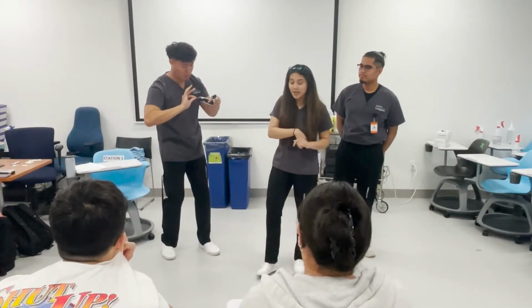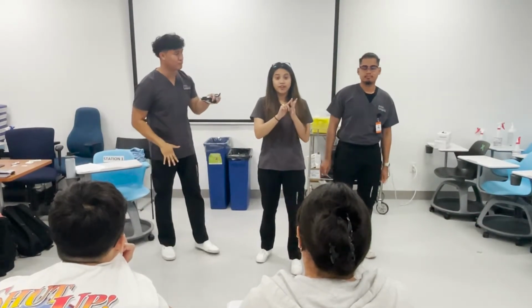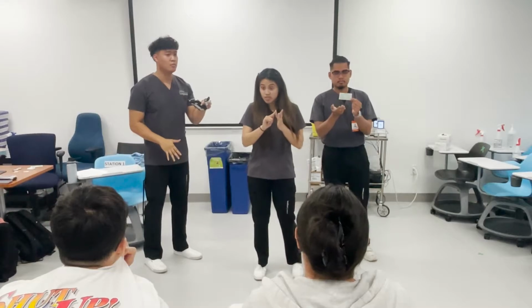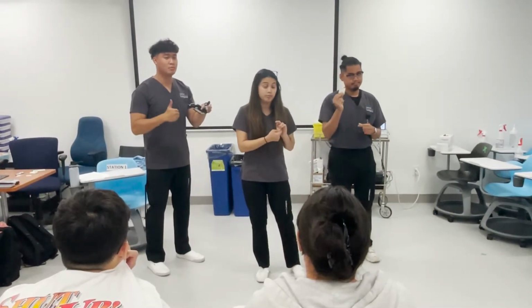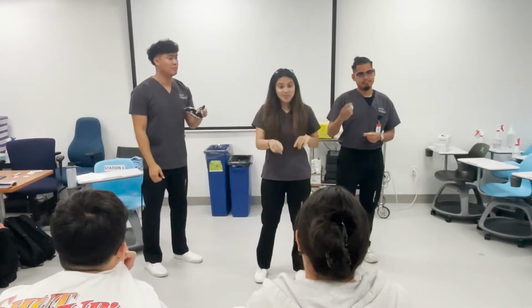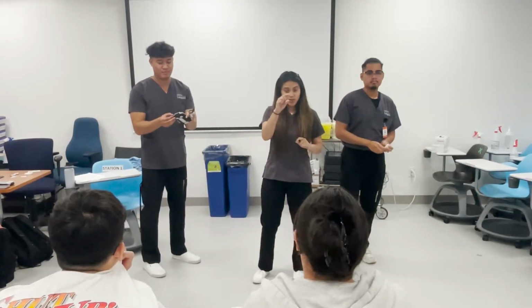Then the next step is to clean your finger. Wherever you're going to prick yourself, you want to make sure that it's clean so we're not introducing any bacteria into your blood, okay? Next, we're going to be taking the lancet, or the little needle.